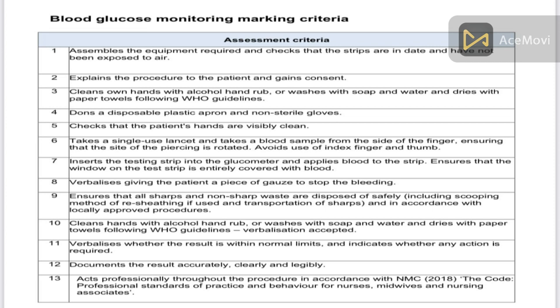Mr. X, your blood glucose level is [reading]. I am going to dispose of the waste material. I can see that there is no bleeding on your hands. I am going to do hand washing and documentation. If you feel any discomfort, kindly inform me — I am here to help you. We will then complete the documentation paper.